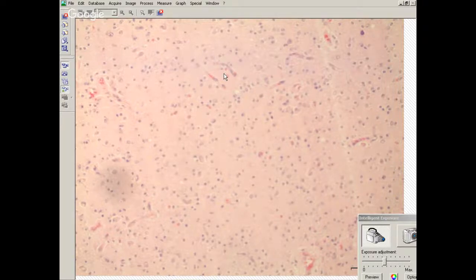So if you get a tumor that looks like a low grade, you think it's an infiltrating glioma, and you think it's either an oligodendroglioma or a diffuse astrocytoma, you have to now determine whether or not there's an IDH mutation. If you can't do that stain, then you have to say oligodendroglioma not otherwise specified to indicate that the IDH mutational analysis is not done. Or if you don't have the FISH for 1p19q codeletion. If you have FISH and it's 1p19q codeleted, it's going to be an oligo. It's always good to confirm that it does have the IDH mutation for prognostic purposes.